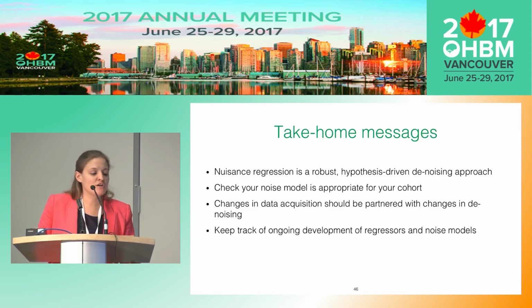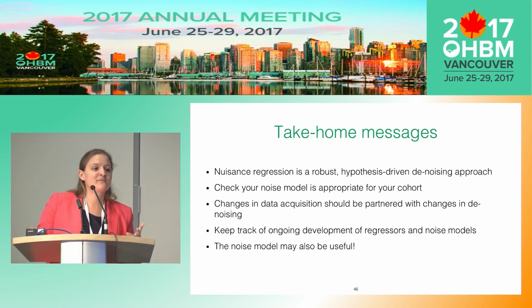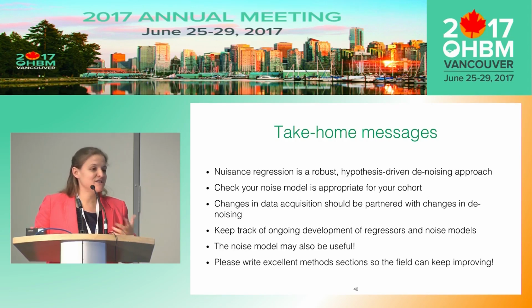You should keep track of ongoing developments in specific nuisance regressors, noise models, and regression approaches, because this is an active field. And as came up in some of the questions earlier, the noise model itself might be quite useful if you want to understand physiological differences between participants or cohorts. And finally, just a plea: let's all make a point of writing really thorough, excellent methods sections so that we can understand what it is we're all doing and, as a field, keep improving.